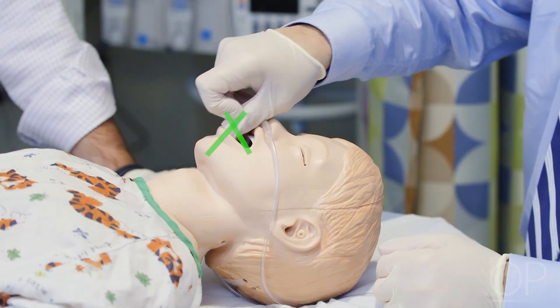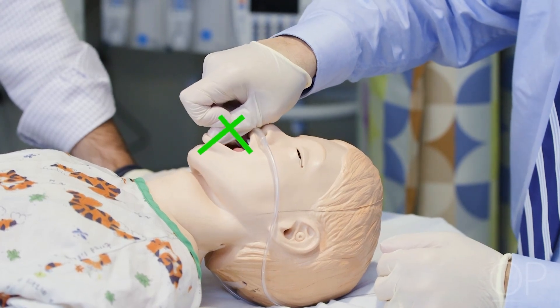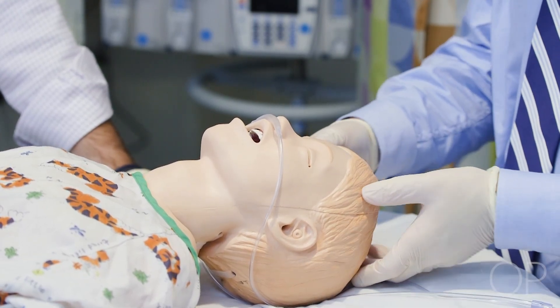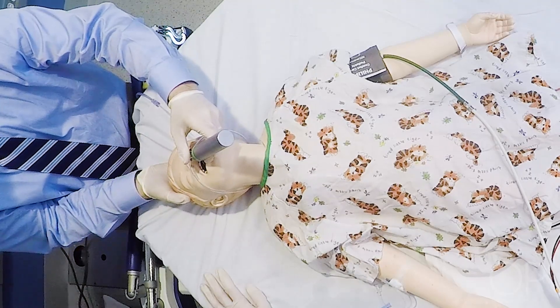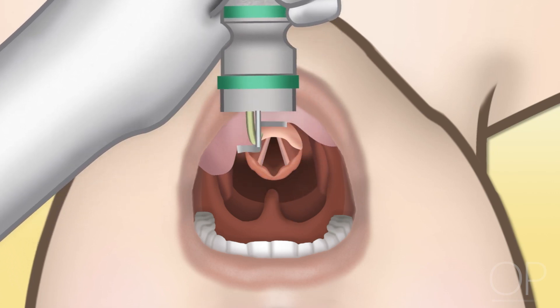Appropriate technique should be applied to open the mouth prior to inserting the blade. A scissoring technique or rotation of the head backward in a neuromuscularly blocked patient can be effective. The blade should be smoothly inserted from the right corner of the mouth using the left hand to hold the laryngoscope handle. The tongue should be swept to the left to optimize the laryngeal view.